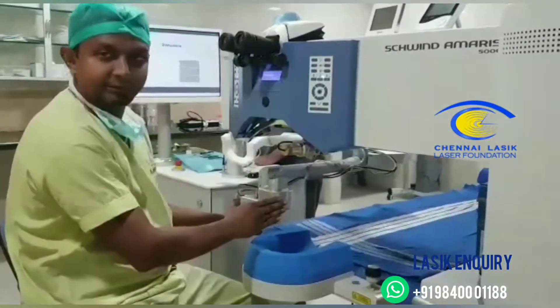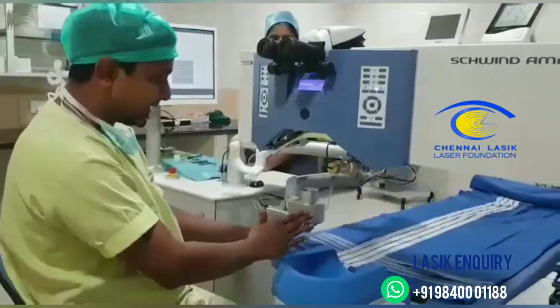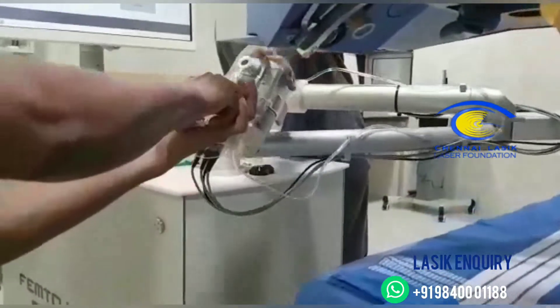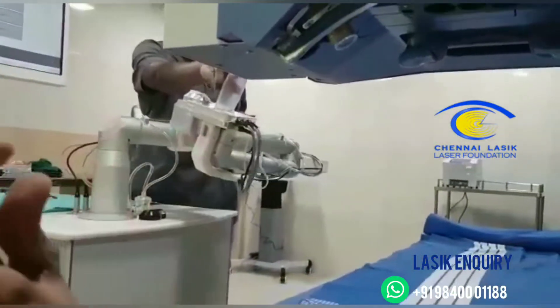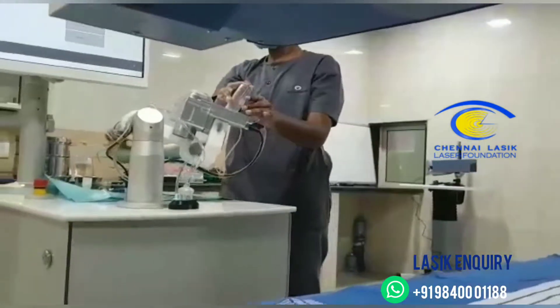Once the Femto part is done, the suction is automatically released. When I take the instrument, all I have to do is turn it and give it to my assistant, who places it in a lock. Once the lock is done, the arm swings right back into position.